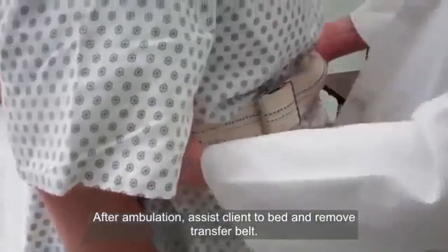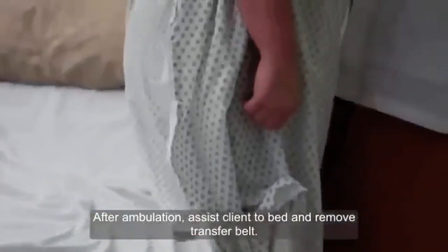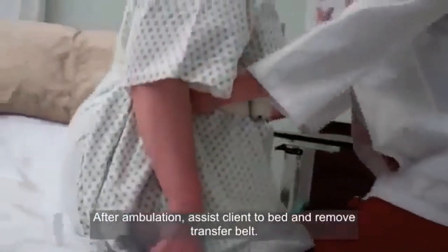Do you feel the bed on your knees? Yes. Go ahead and sit on three. One, two, three. Wonderful.